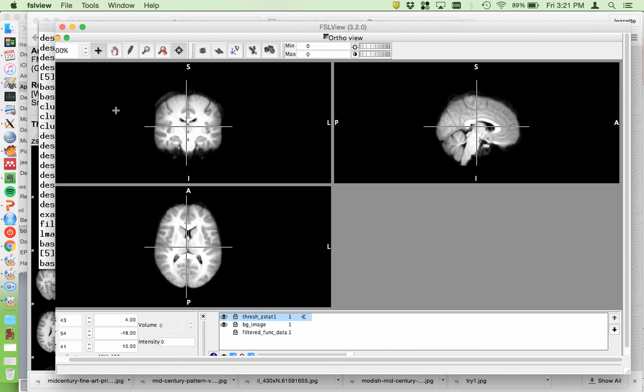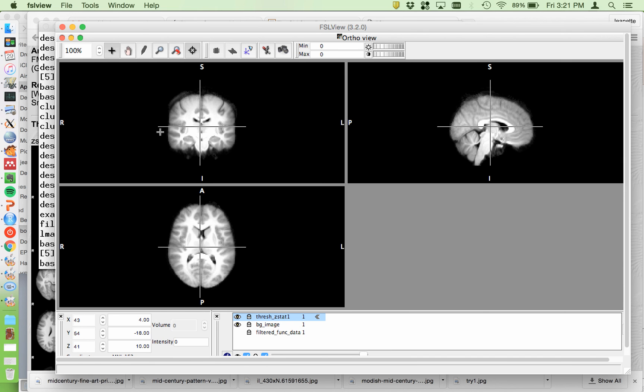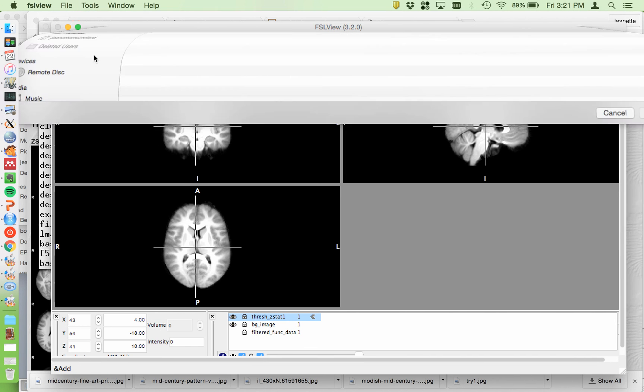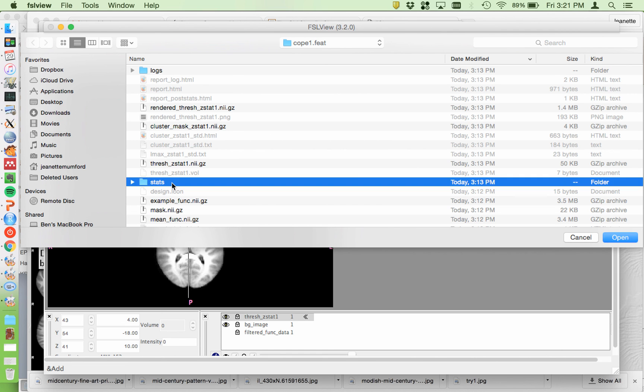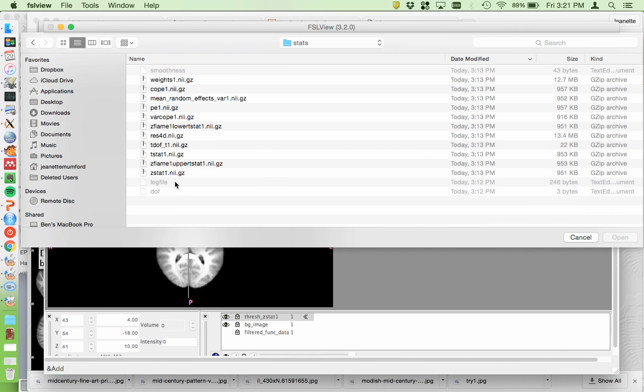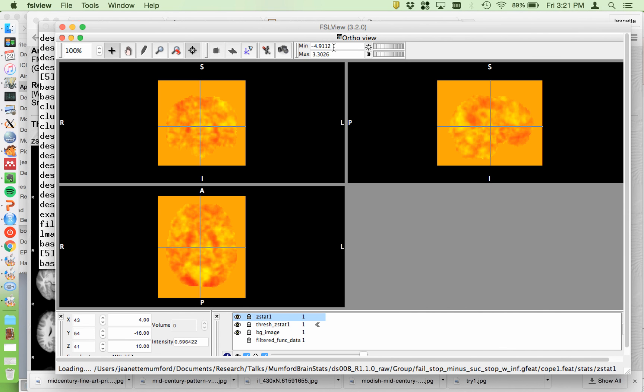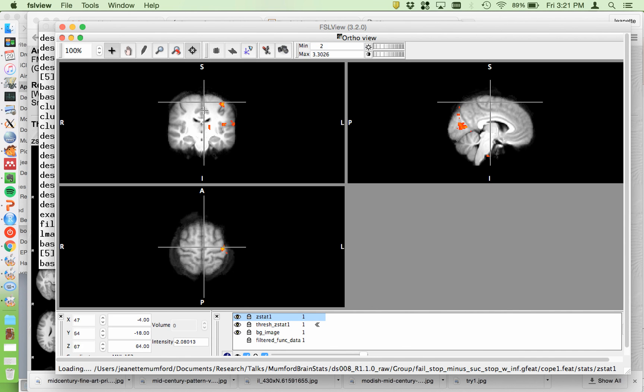And you could do an uncorrected threshold. So zstat1, and I could choose a threshold of 2, so it's uncorrected. And now I can see what was subthreshold in the brain.